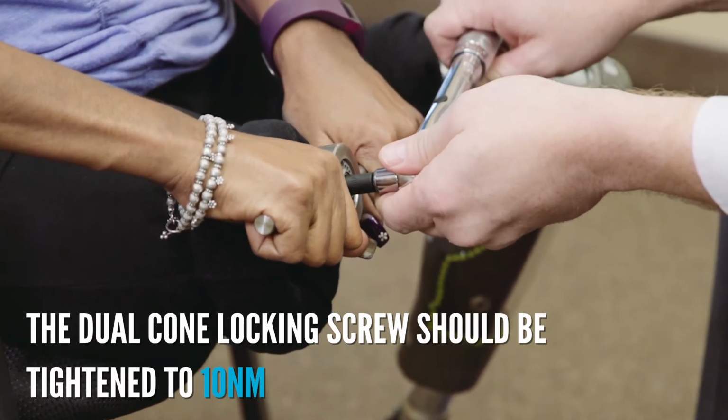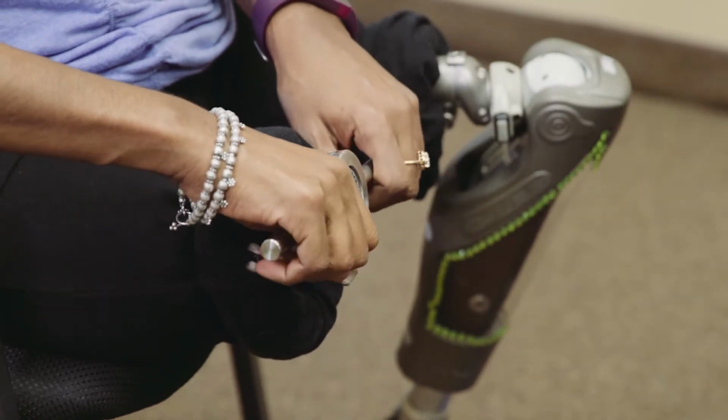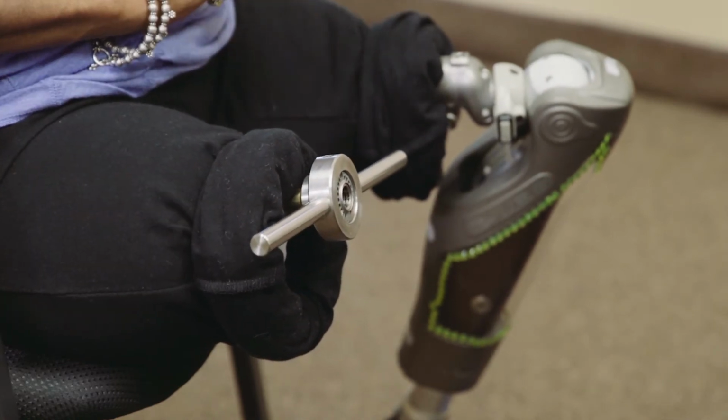All parts must be cleaned and inspected regularly. If any movement within the system is ever seen, the system needs to be checked by a prosthetist to see if any wear or settling has occurred or if any loosening has occurred as well.